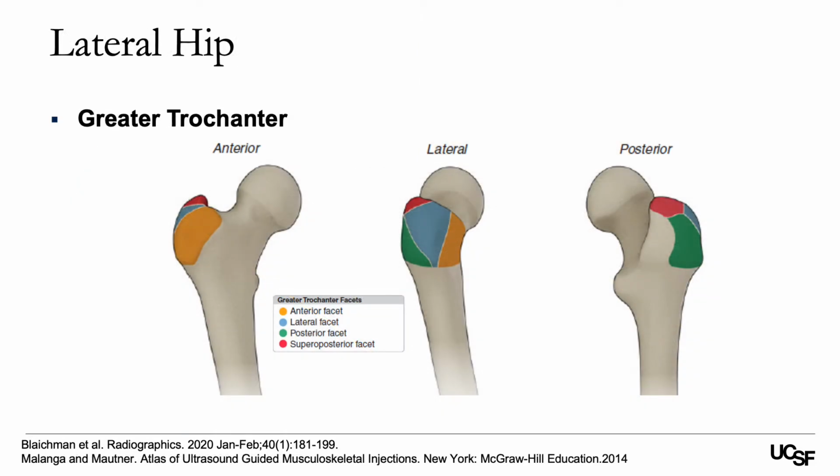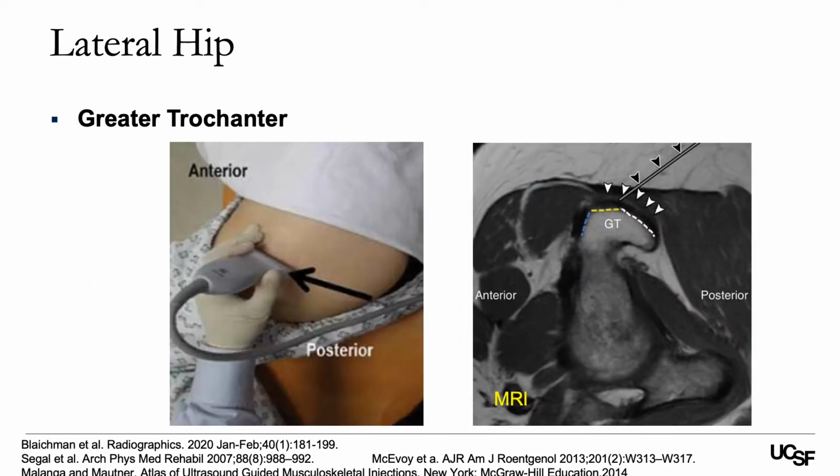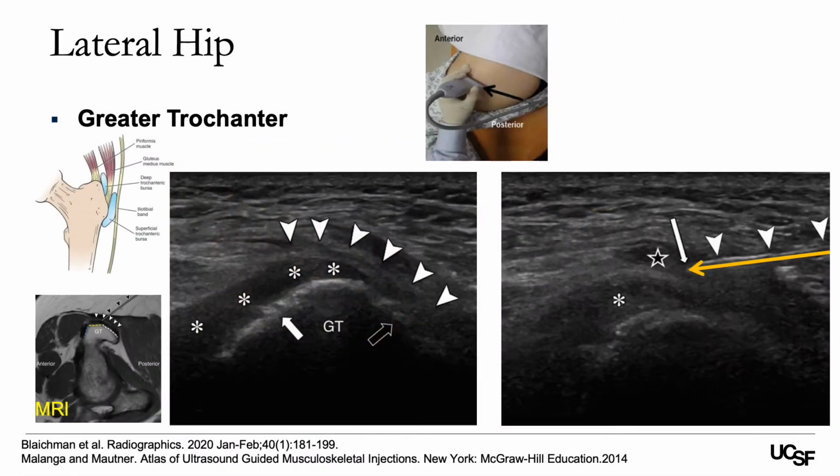Greater trochanteric pain syndrome is characterized by pain and tenderness over the lateral. The symptoms of greater trochanteric pain syndrome can be caused by bursitis. For injection, the patient is placed in a lateral decubitus position with the target hip. The spinal needle is advanced in plane with the transducer beam from posterior.